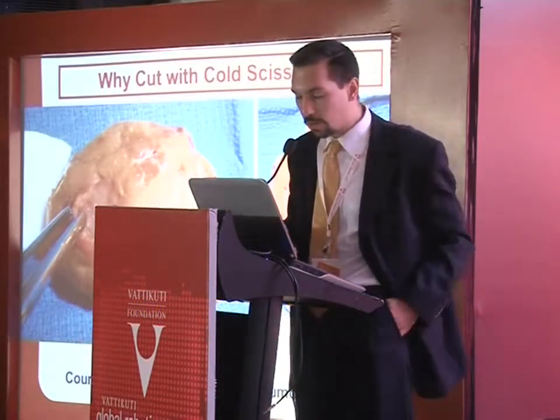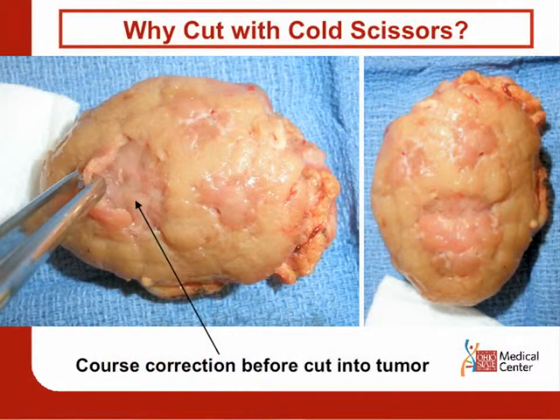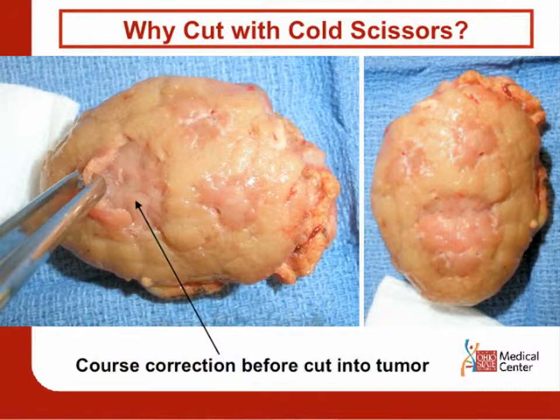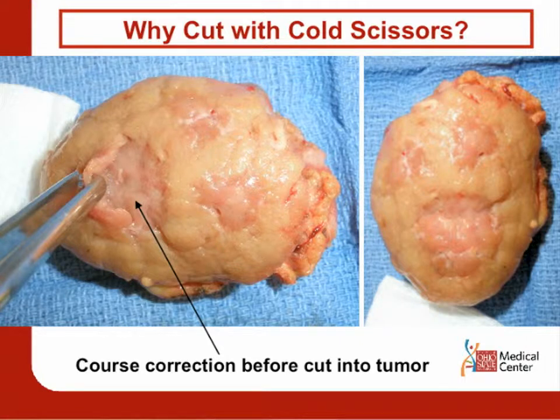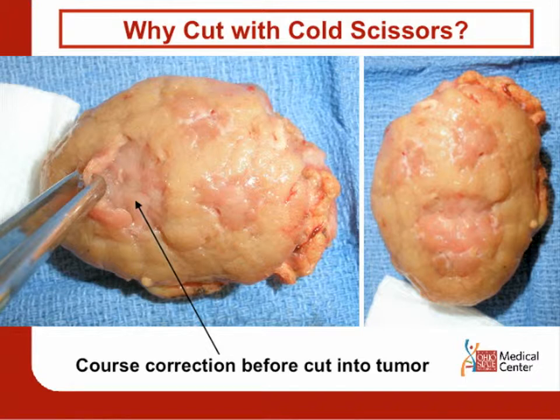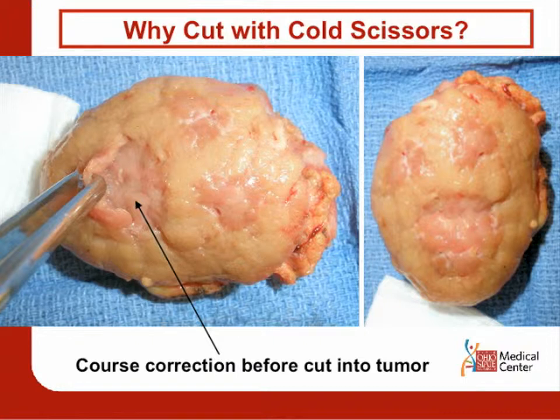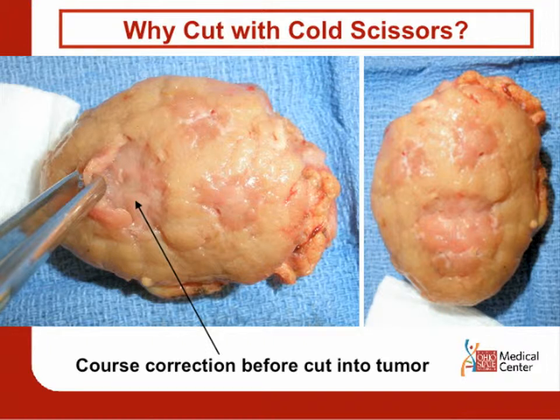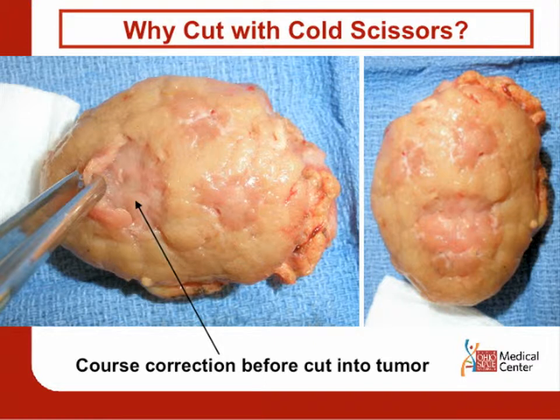This is why I recommend cutting with cold scissors rather than cautery. Here's an example — this was a tumor where I was cutting along the deep margin. As I was cutting, I started getting very close to the pseudo-capsule, so I backed up and went a little wider, giving myself an extra millimeter of parenchyma. This is something you wouldn't be able to see with cautery. With cautery, you can't tell the difference between tumor and normal kidney. With cold scissors, you can see this and tailor your margin — one millimeter, five millimeters, or even enucleate.